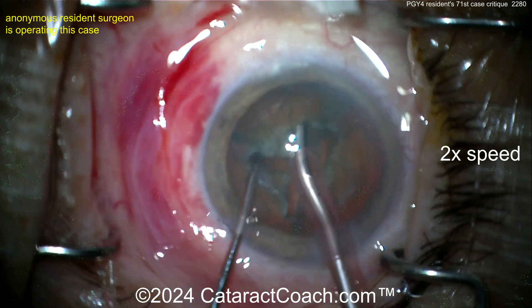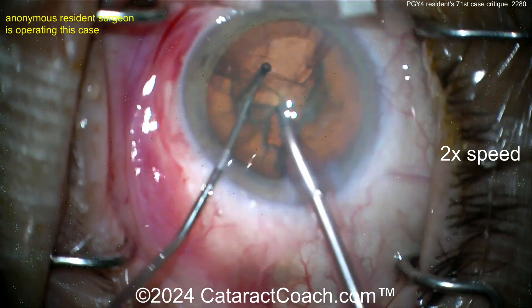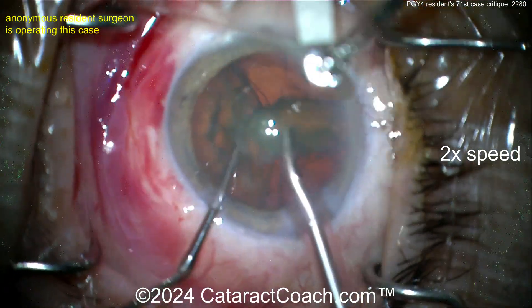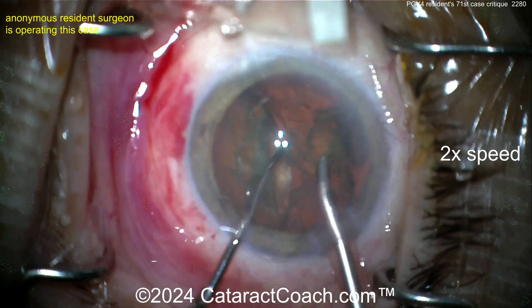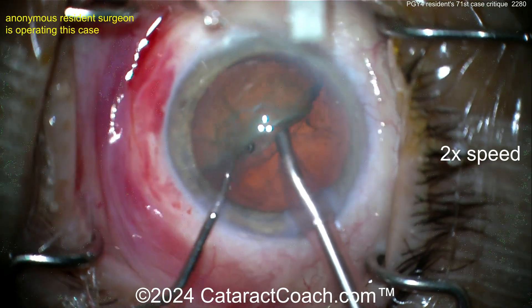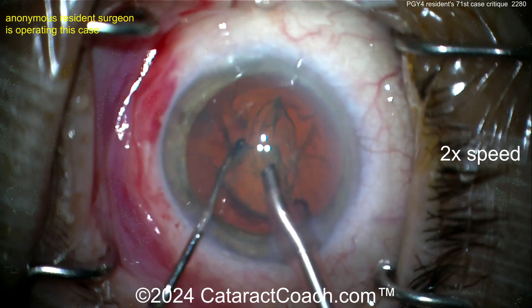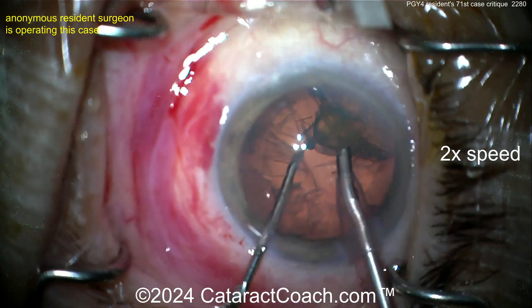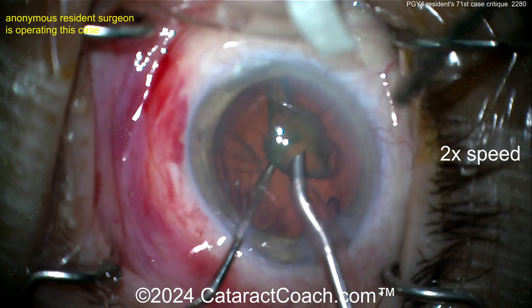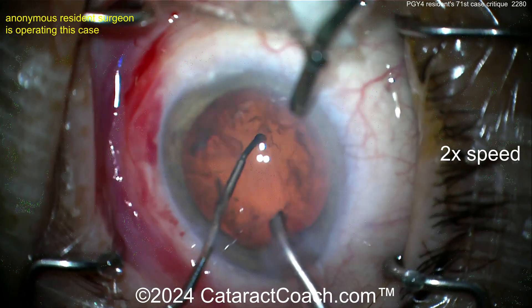Ask yourself: what should the phaco settings be here? On cataractcoach.com there's an entire 25-part curriculum — watch one every weekend for six months and you'll learn how to set up all these parameters. Don't just copy your co-resident or ask the rep — you're a thinking resident. There's the other half — a chop, I like it. Kind of divide-and-conquer, kind of stop-and-chop. My advice: next case, commit to stop-and-chop. Getting that last piece out — nice attending holding the drape out of the way.